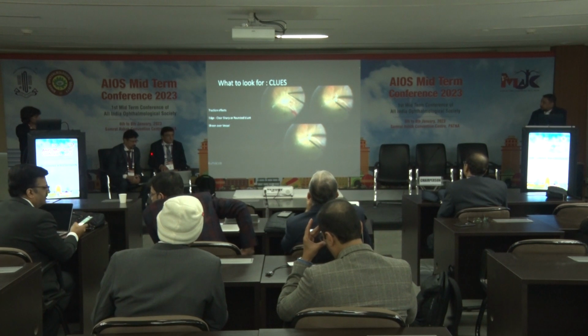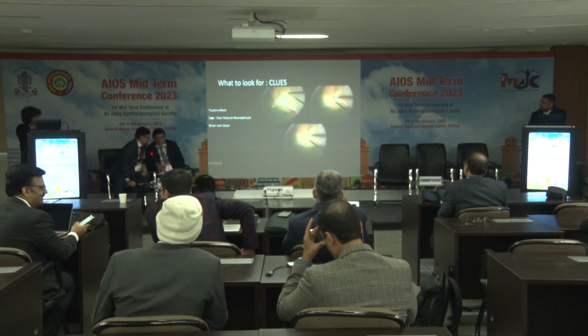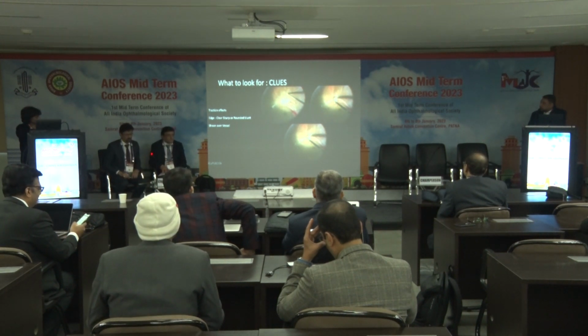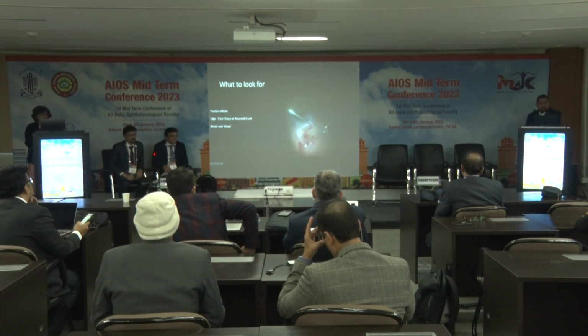And these are just a few tips. One, look at the vessel. If you see a translucent membrane over the vessel, that's an example of the second membrane. You can see when you pull it, a strand going towards the periphery. That's another tip to find it. And you can also see a fold happening. That is a tractional effect when you pull the second membrane off the TRD.